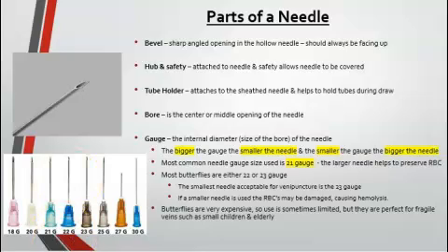The safety of the needle is going to be attached to the needle, and this allows for the needle to be quickly covered or safetied after completion of a blood draw. The tube holder attaches to the needle, and it helps hold the tubes during the blood draw, and we'll see a little bit later on what this looks like.